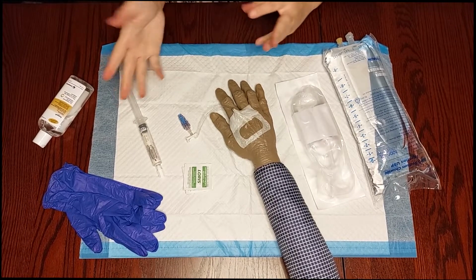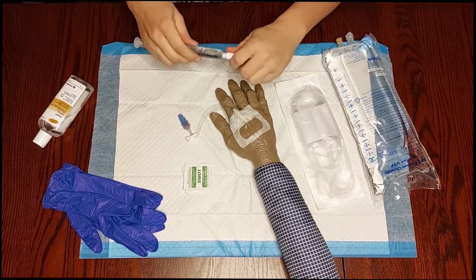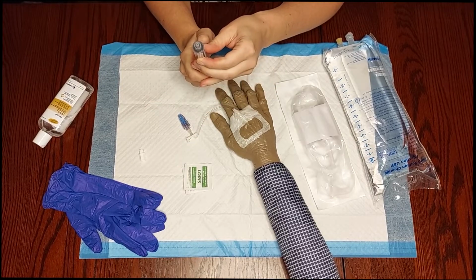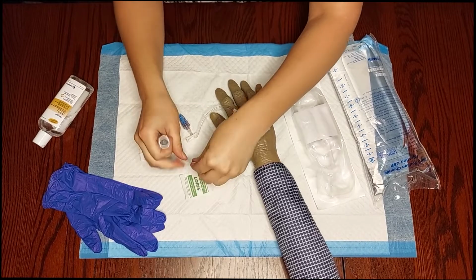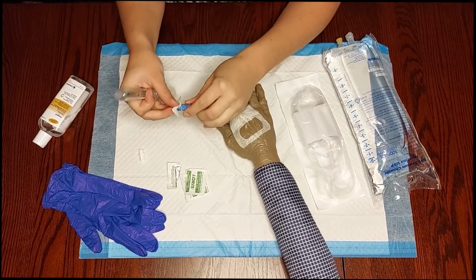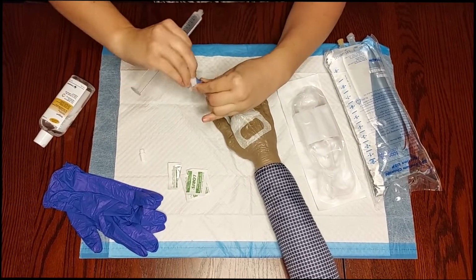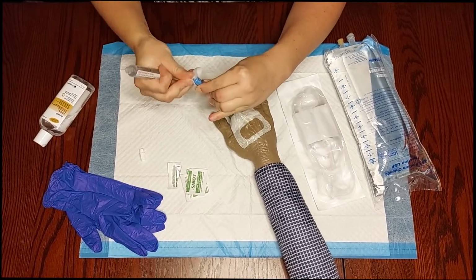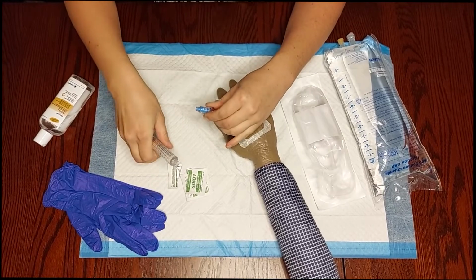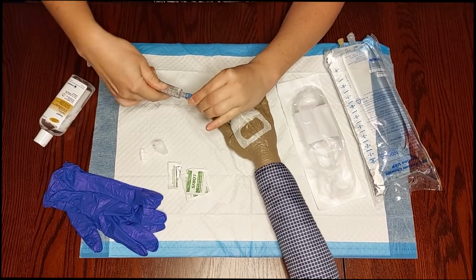For the next part, you can wear gloves or you don't have to. Your hands are clean, so you technically do not have to wear gloves for this. We're going to remove the air bubble, because they always come with an air bubble. Then we are going to use our alcohol swab and clean off the stopper. You want to clean it really well, making sure there's no dirt or germs. And then you push this in and twist.